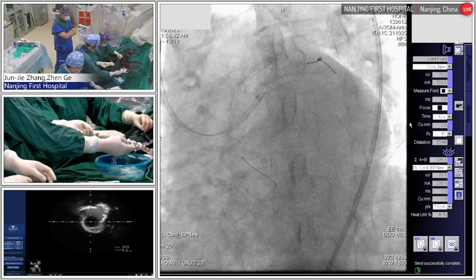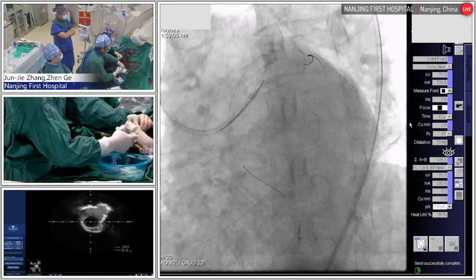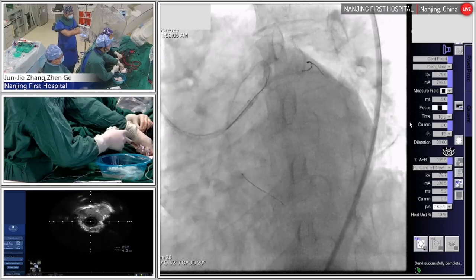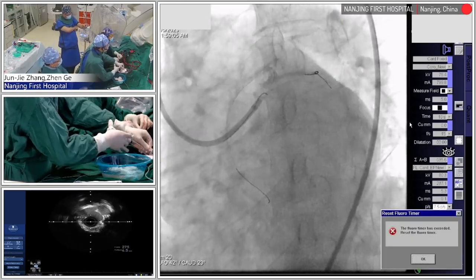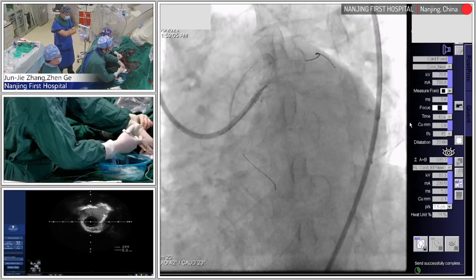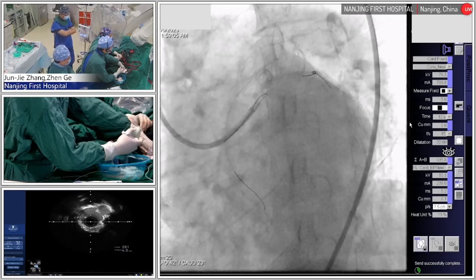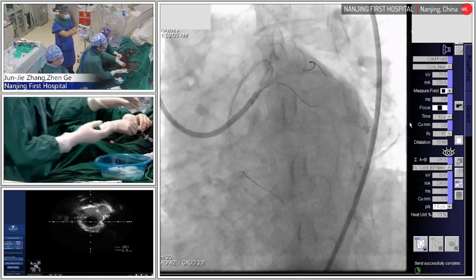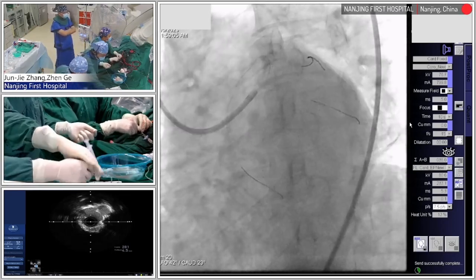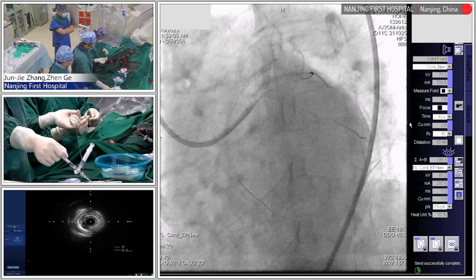Then we rewire the side branch. Yeah. For choosing, very short. Can we see the two layers of stent structure from the IVUS? I mean at 1 and 1 to 2 o'clock. What's the phenomenon, Dr. Pan? I did not see the overlapping stent layer at this time. What do you think? It's just here. I think maybe we still need a... Here is the side branch. Okay, thank you. Check IVUS. Okay, okay. For now, LAD. Okay.